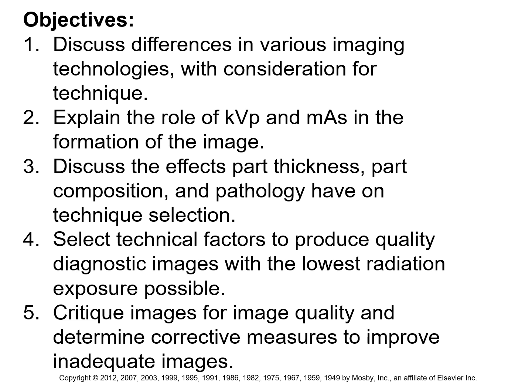If he's wiggling all over the place, we don't have to hold him still for 2 seconds. We only have to hold him still for 2/100ths of a second. And that's possible. We can actually accomplish that.